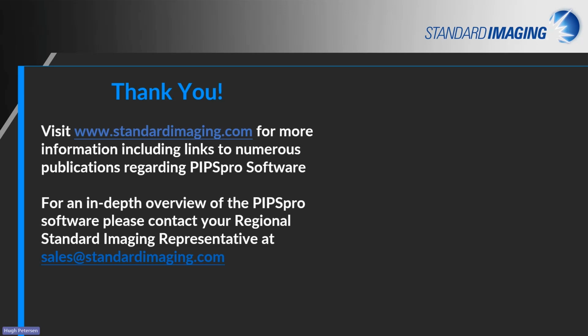Awesome. And I do see you're planning to upgrade to TrueBeam 4.0 in January, and asking whether the log file analysis is compatible with the newer system. That came as part of an update to version 5.8 of the software, which is available now.